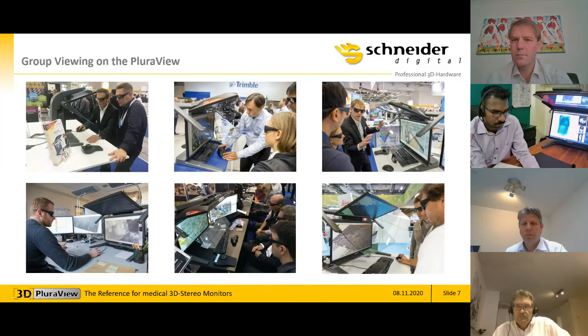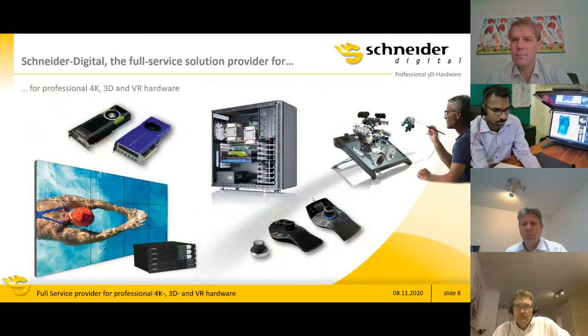They can come and see this, and you've seen the presentation by Arjen and by Mark. The images on Vesalius 3D are so clear and so easy to understand. So I think this is a big positive factor of using such a system.